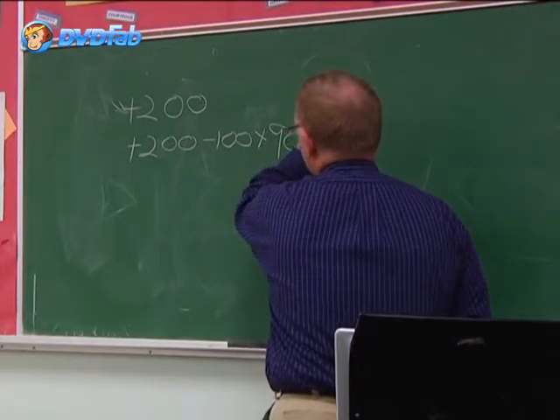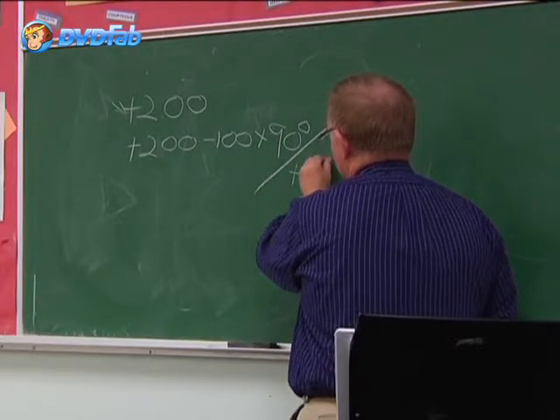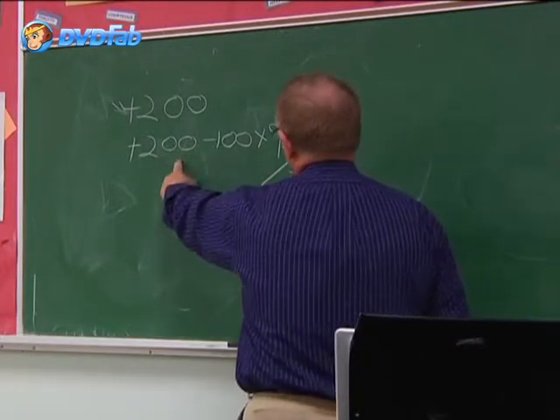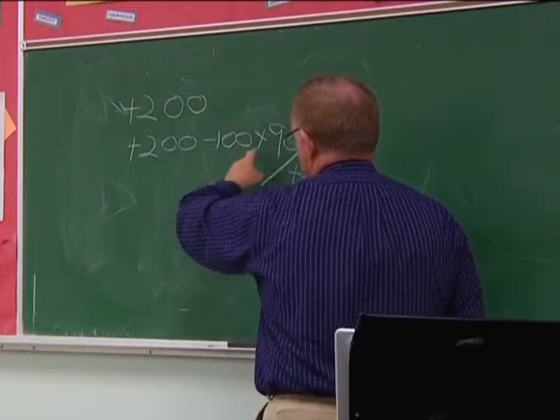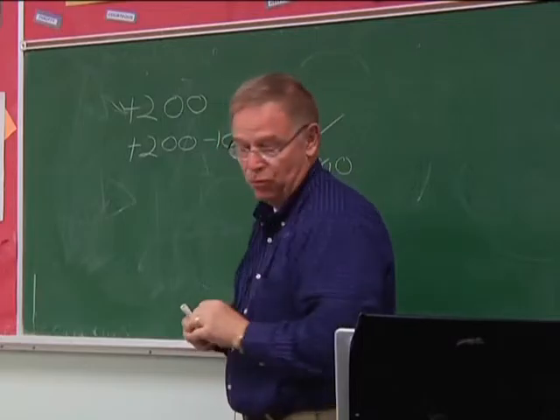And if you have 3 numbers with a slash and then a 4th number, that means it's a sphere, an astigmatism correction, and a bifocal.